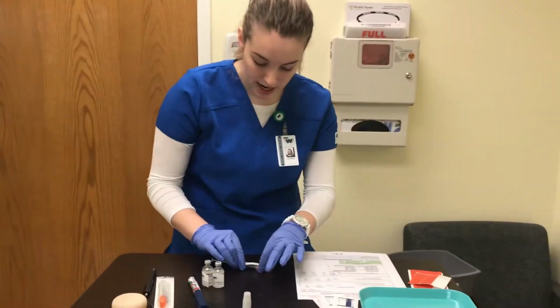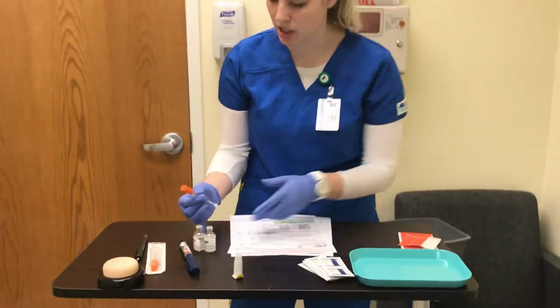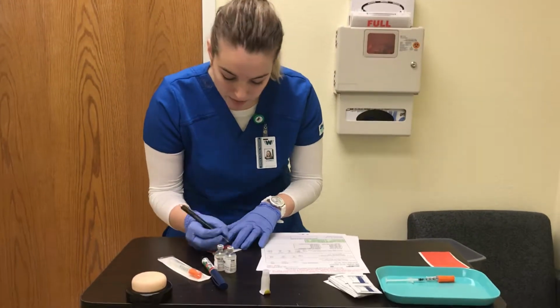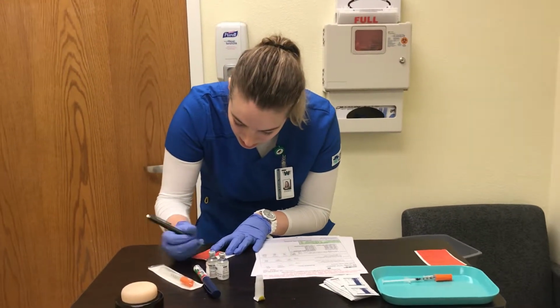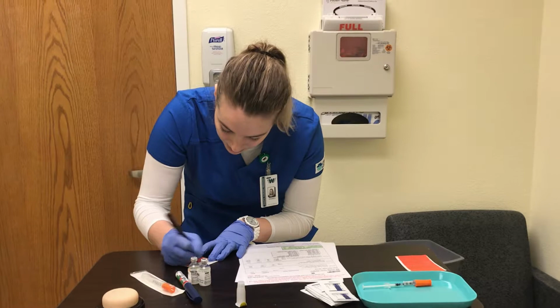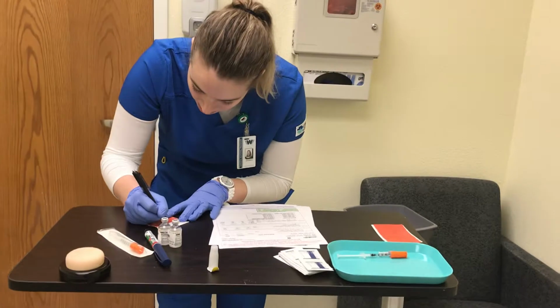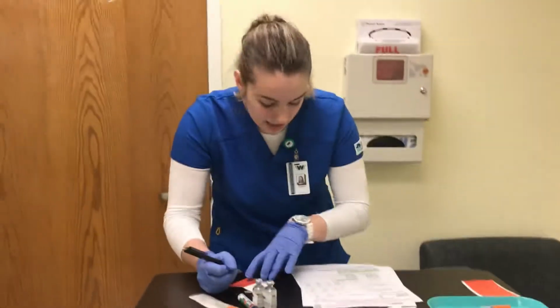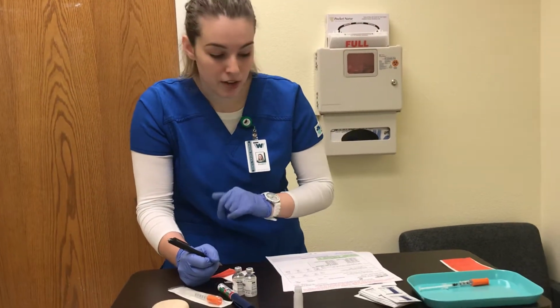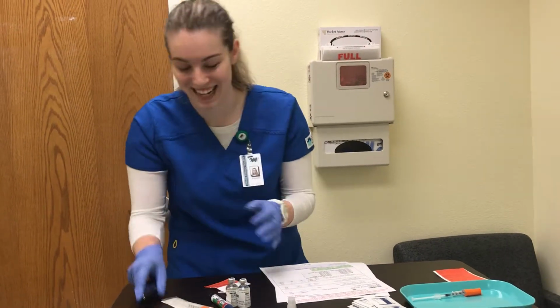and grab it by the sides and push it down just so then it can't poke out the top just in case. So now that I have that, I will label. So I have my NPH and I have 15 units of that, and then I have my regular and I have 10 units of that, and it is October 9th of 19, and these are my 5:30 p.m. meds, so 17:30, and it is 17:15 right now.